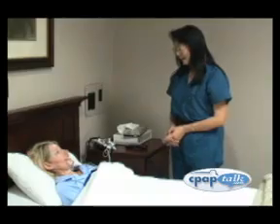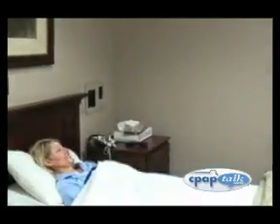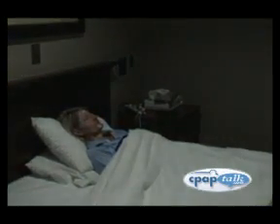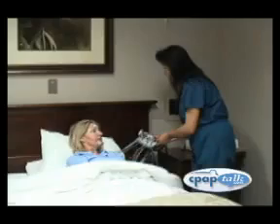Your technician is monitoring your data for quality and any sleep disorders. Their job is to keep you safe while fully documenting your sleep. All those probes you put on are now collecting data that will provide a detailed story of your night's sleep. A definitive diagnosis can be made later by a physician sleep specialist using the data collected.